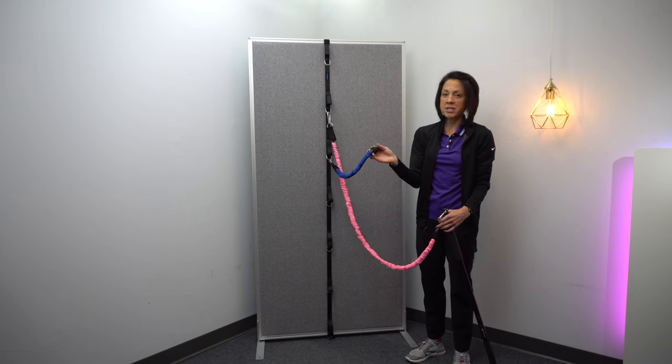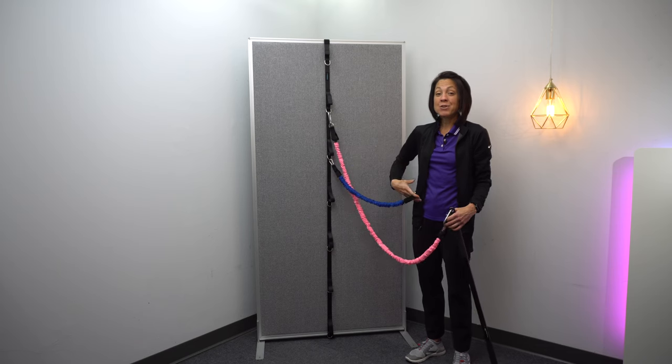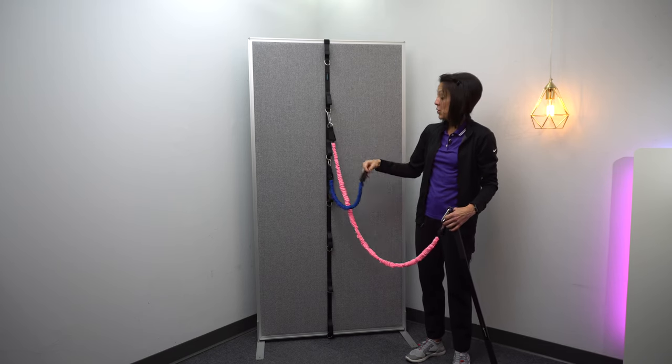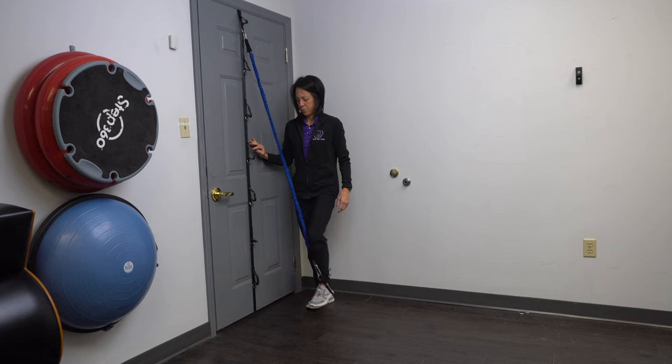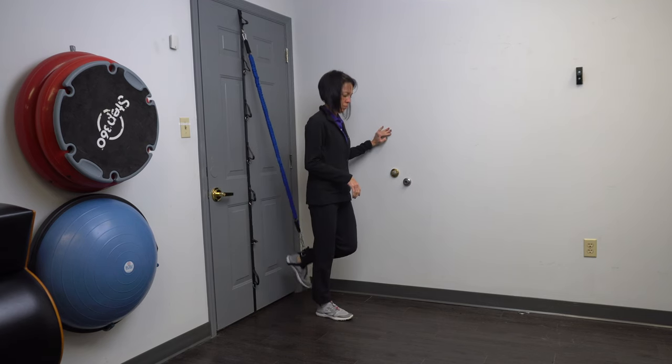these shorter bands I find to be pretty ideal for those situations. Also, instead of using the resistance band belt around your waist, you can actually use this strap and work on active assisted hip flexion, active assisted knee flexion in standing.